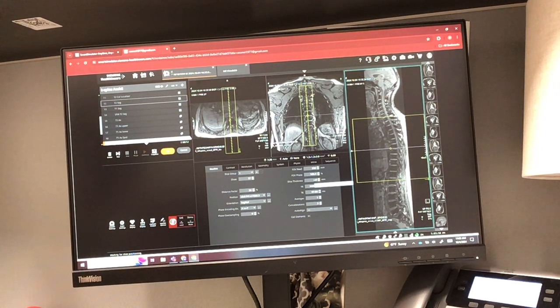I need to be at 4 slice thickness and 1 gap for this one. Which is different, okay? This is different, so make sure you pay attention to your paper, because this is different than your one on your without.